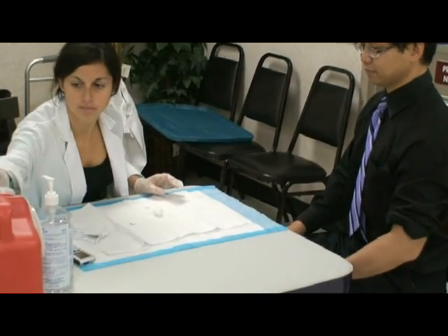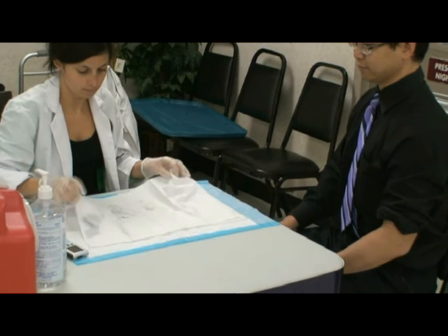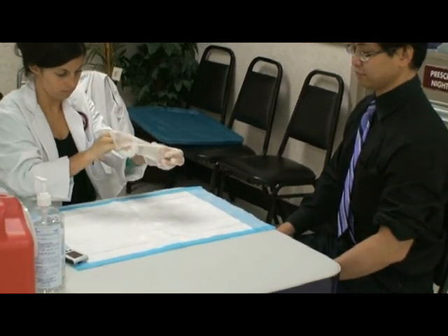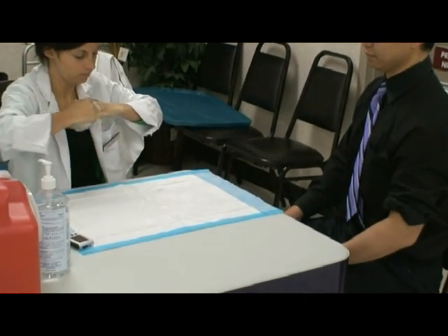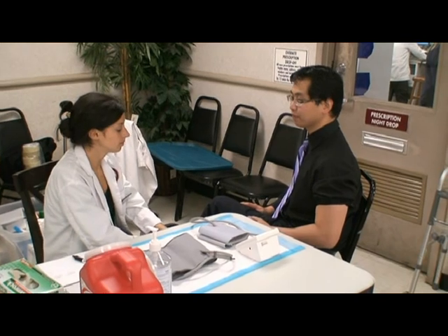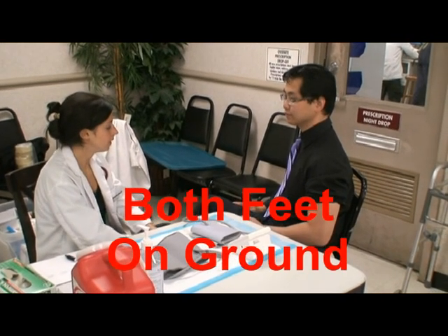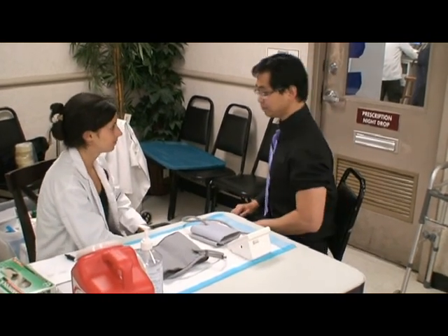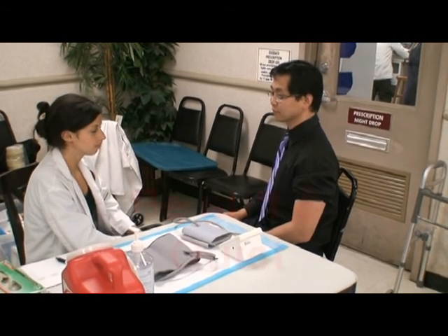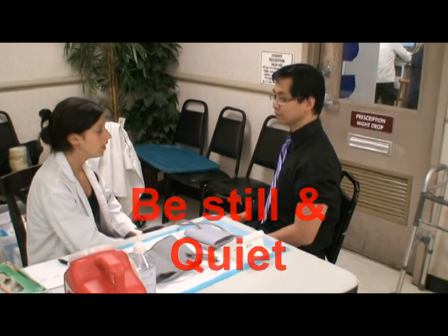After placing the sharps in the sharps container, pack up everything, roll it into a ball, and fold it into the gloves and dispose of it before beginning the blood pressure testing. Now we want to make sure that both feet of the patient are on the ground. Could you please uncross your legs? We also want to tell the patient not to talk while we perform the blood pressure measurements.